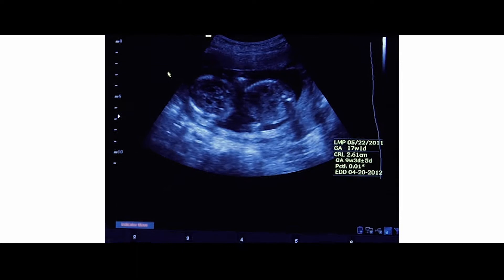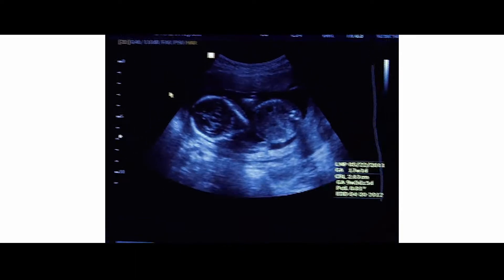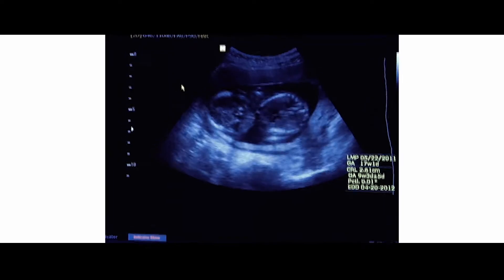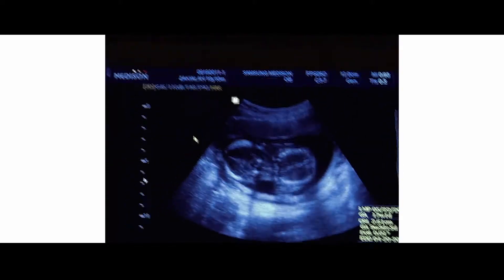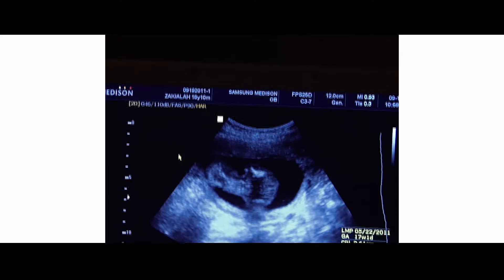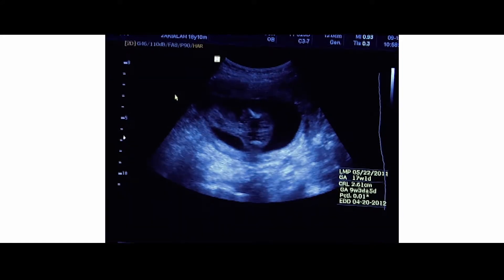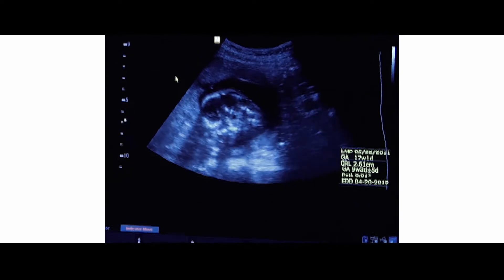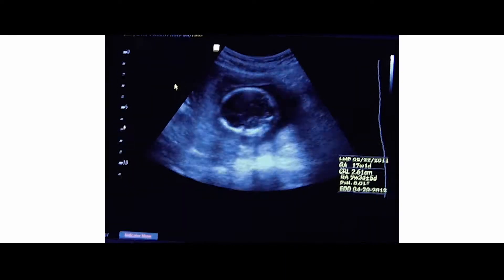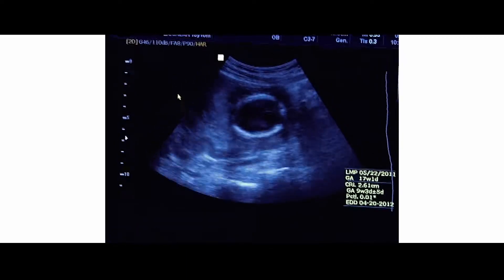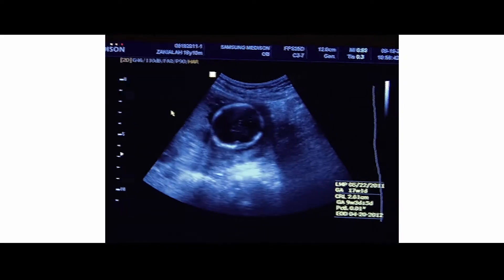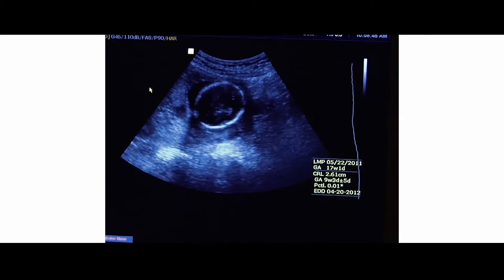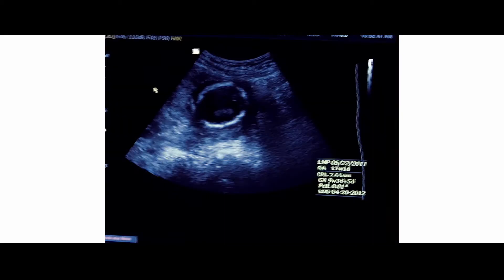There's the baby — it's up by her head. If I angle toward mom's feet those are eyes; if I angle toward her left shoulder there's the spine. So this baby's lying just like this. I'm going to go 90 degrees to the fetal lie. We know the head is over toward mom's right, so here's the head — we're going to try to get a nice BPD by getting a nice oval. It's looking up, we want it to move, we want it to turn its head. We're very close.